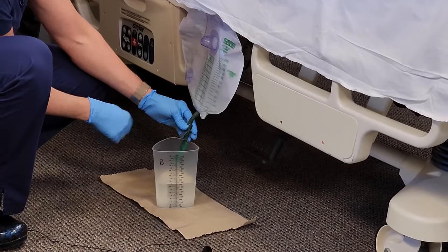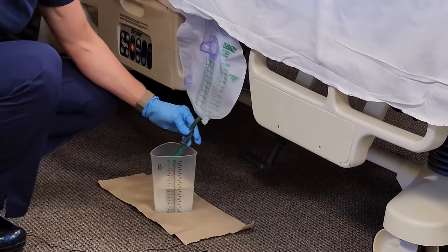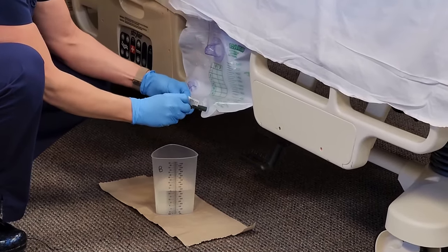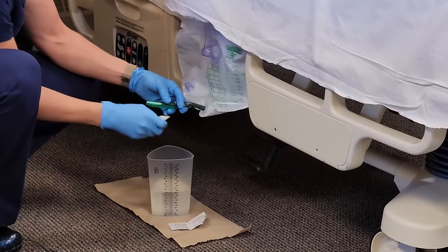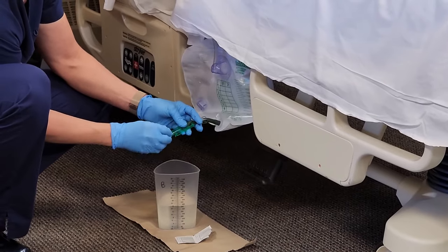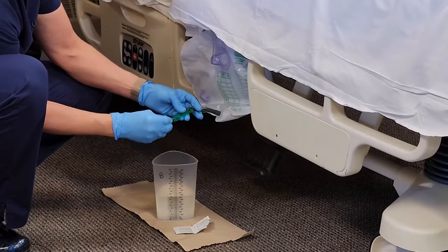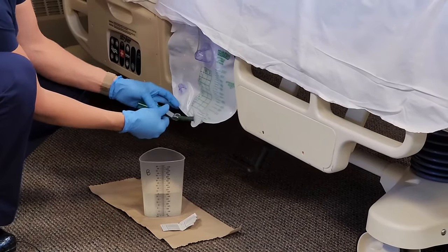We'll get all of that out, put the clamp back on, and get that out of the graduate. We'll take our alcohol and clean this part of the spout. Get in as far as you can, but you don't want the pad to get stuck in there. Then clean out the holder that the spout goes into.